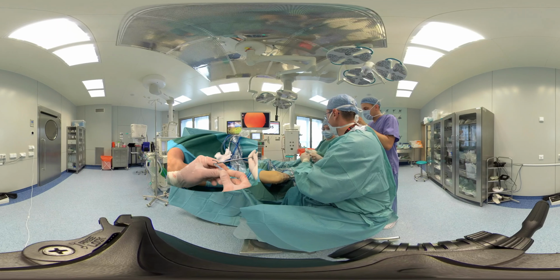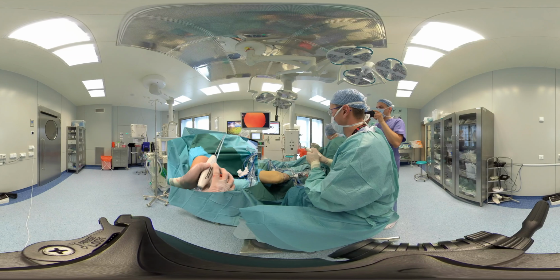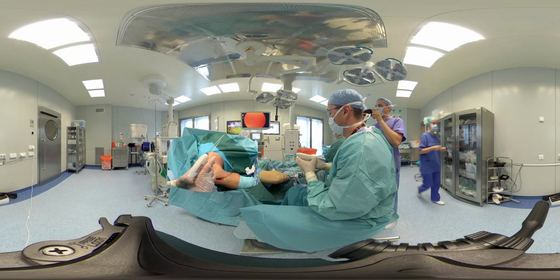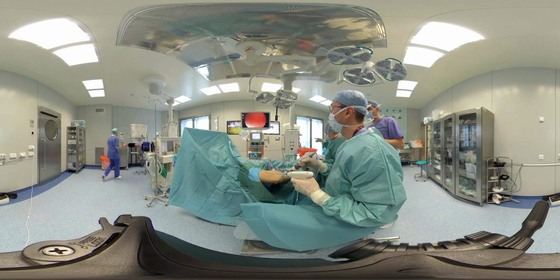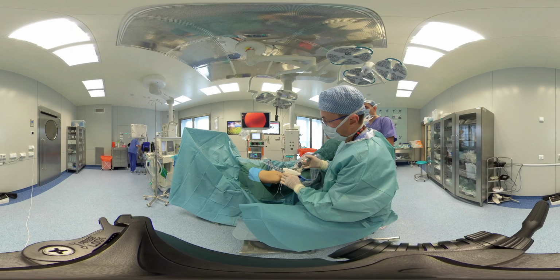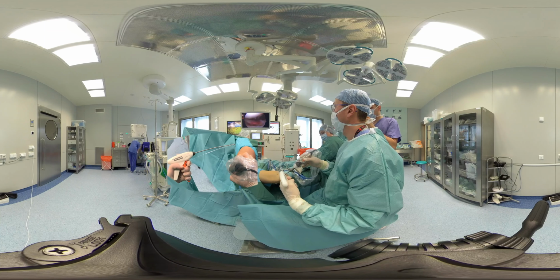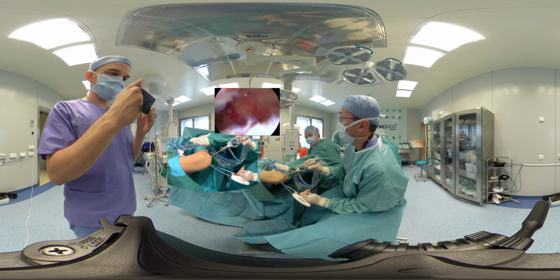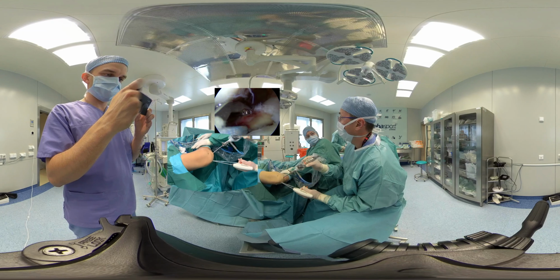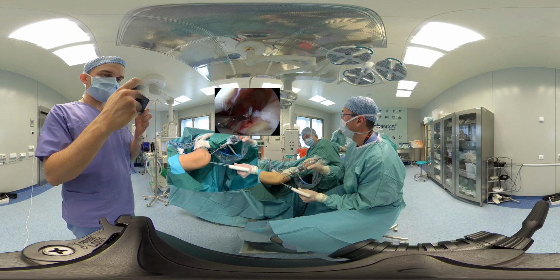Instrument for stabilization, FirstPass Mini: there are 3 types: straight, turn right and turn left. In this case we use a straight FirstPass Mini. We use it from the lateral portal, keeping the camera head in the medial portal. We put on the first suture.